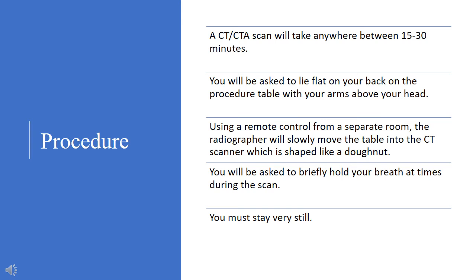You will be able to hear the radiographer at all times, and they will be able to communicate with you and see you from the next room. So if you need a break or become anxious, you can let the radiographer know and they will make you more comfortable.